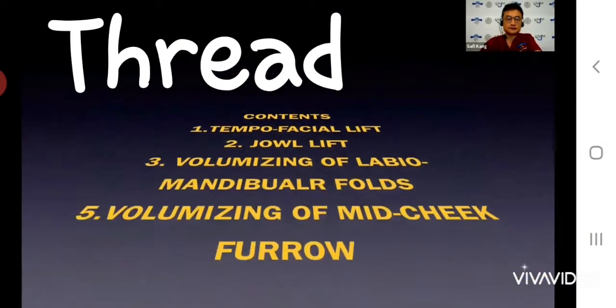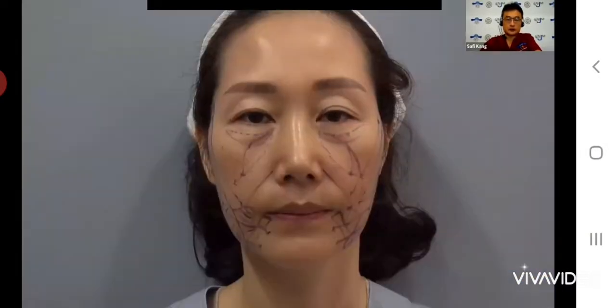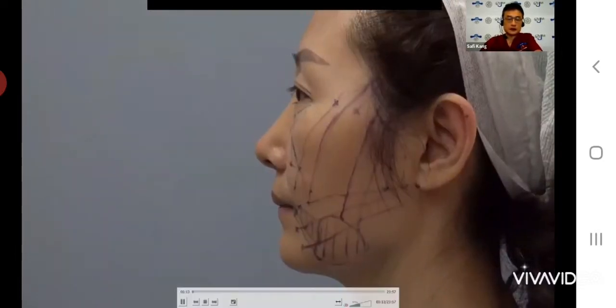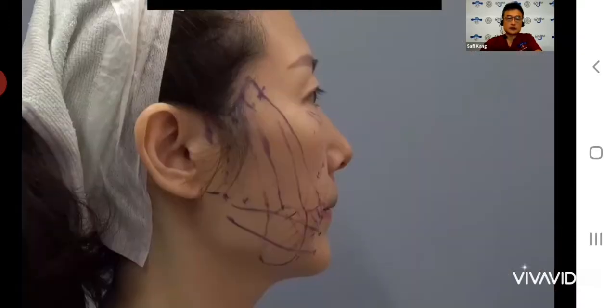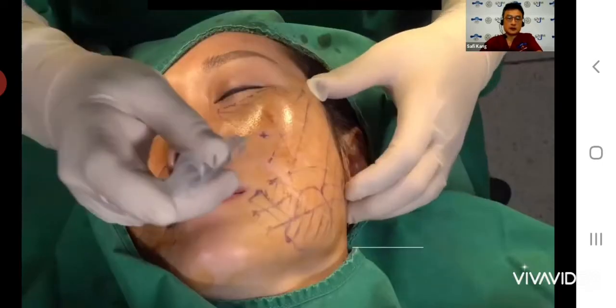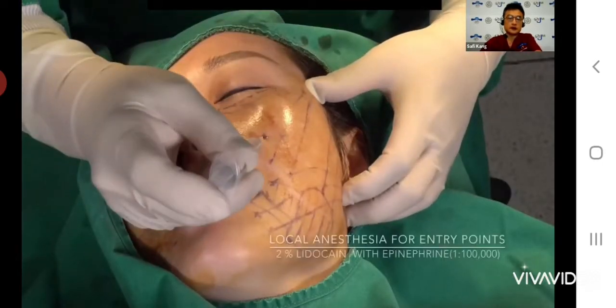Urgently, the committee wanted me to show my video about something. So I selected thread lifting. This is the one case. Yeah, so I tried the face and temporal thread lifting.